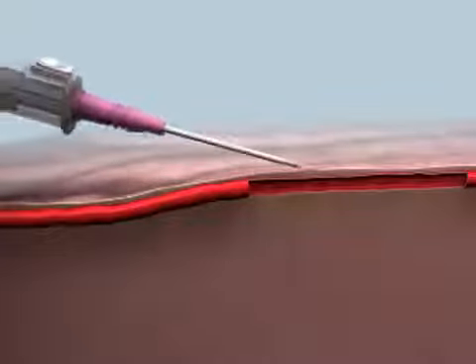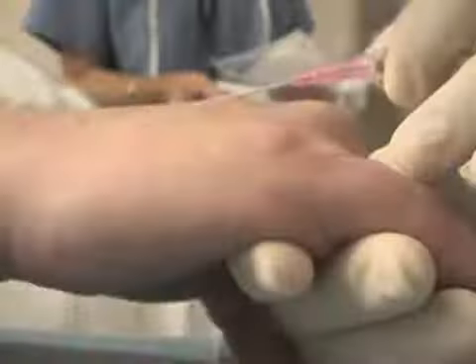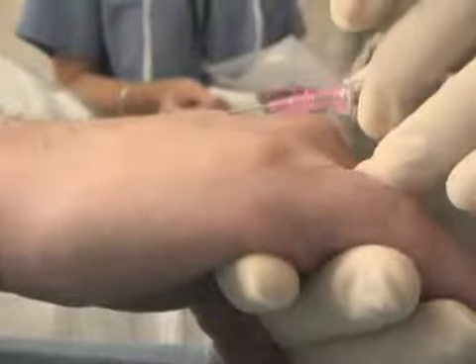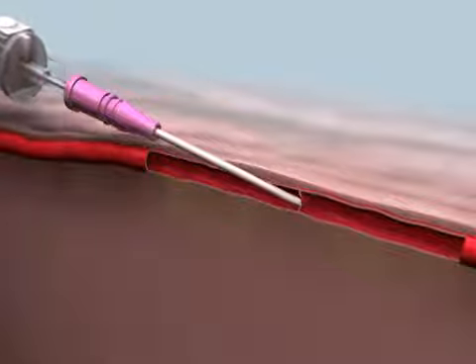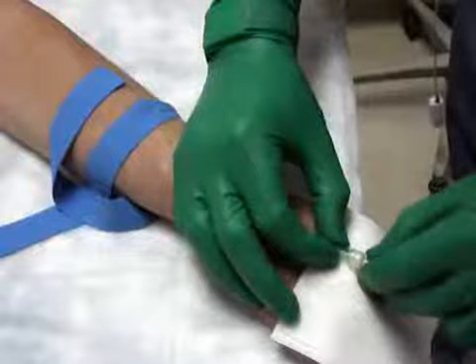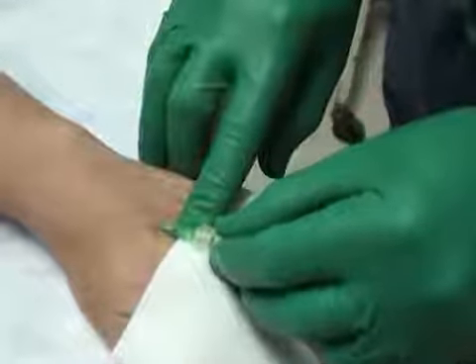These have been shown to improve the success rate of the procedure and to reduce the amount of time needed to perform it. Blood might flash back into the chamber if the tip of the needle has entered the lumen, but the cannula has not yet entered the vessel lumen itself. This problem can be avoided by reducing the angle of the catheter and advancing the needle a few more millimeters into the vein. A valve within the vein may prevent advancement of an inserted catheter. If this occurs, hold the cannula hub in place, remove the tourniquet, and connect the intravenous tubing to the cannula.